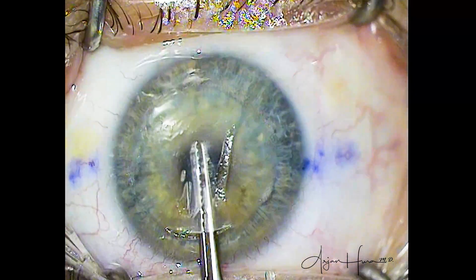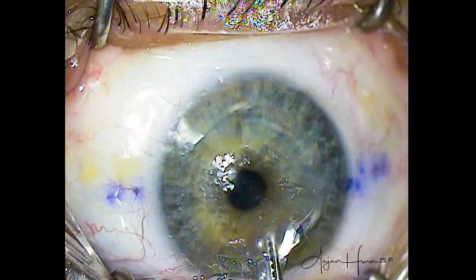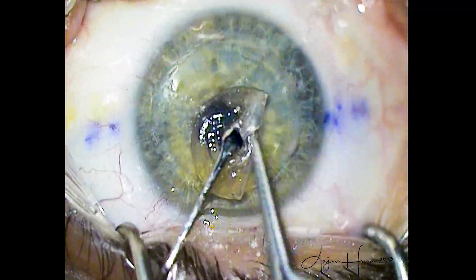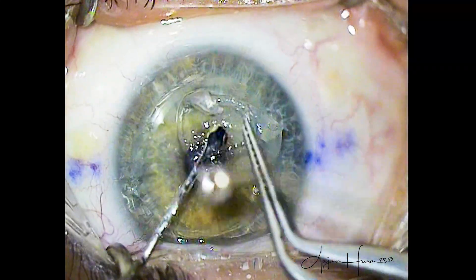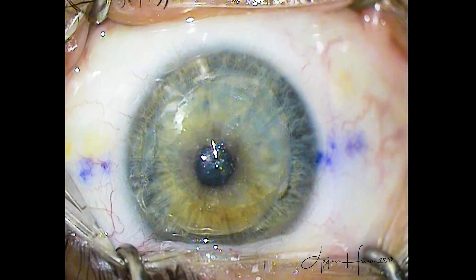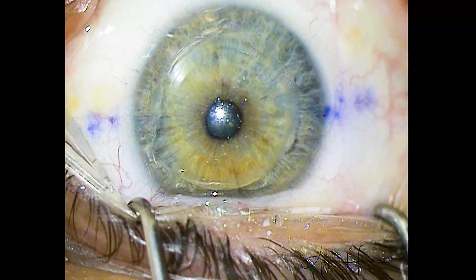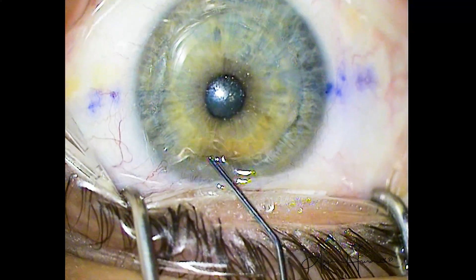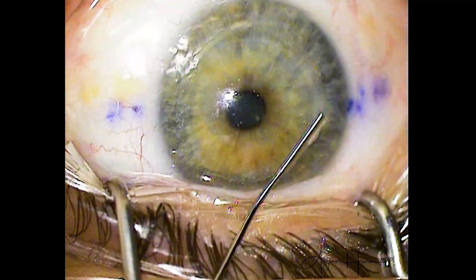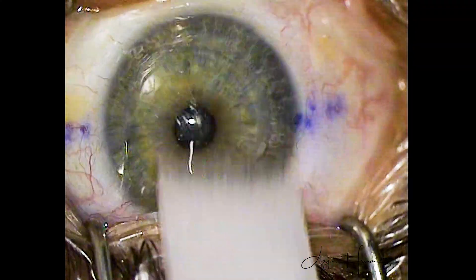Here, I'm just going in with forceps — there's a little bit of adhesion left, so gently I'm using my second hand, going in with the SMILE dissector, and we just gently remove the lenticule out of the interface. And again, I'm just going to spread it out here. This is good muscle memory. I know that the whole lenticule is out, but I do not want to leave any tissue tags behind. They can be removed, but it's a painstaking process — it's much easier to get the lenticule out all in one piece. I do not want to be at the slit lamp realizing I've left a little bit of tissue behind and have to take the patient back into the laser suite, re-drape, insert the speculum, and give numbing agents. It's much easier to just take the few seconds to spread out the lenticule once extracted and make sure you have the whole thing.